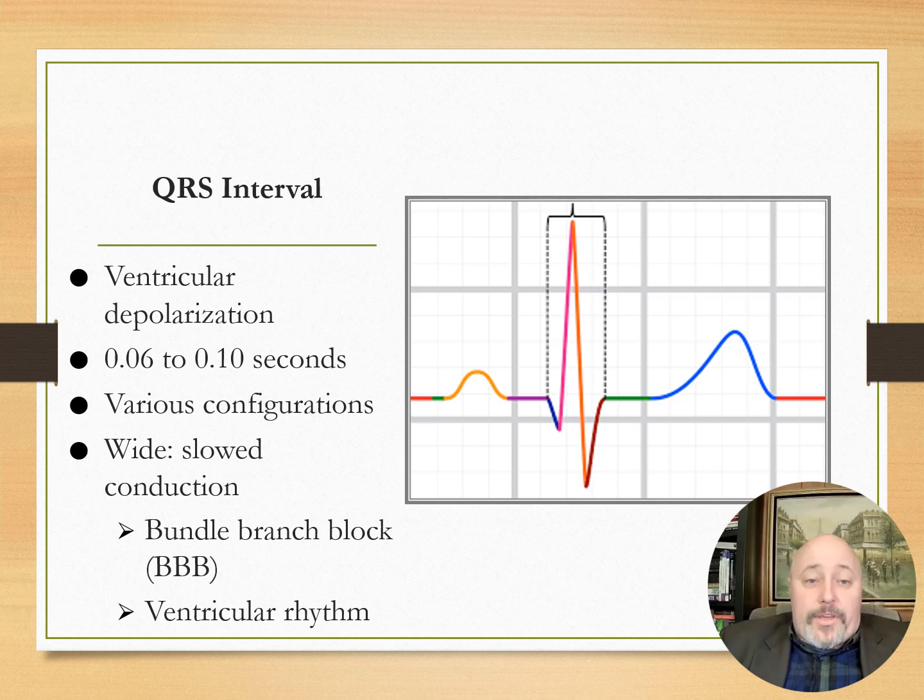On the other hand, the QRS interval is measured from where it leaves the isoelectric line of the PRI to the end of the QRS complex, and you can see we've got that mapped out here on our diagram as well. The waveform indicating the QRS complex, whether it has a Q wave or an R wave, marks the beginning of the interval. The normal width of the QRS complex is 0.06 to 0.1 seconds. This width equals 1.5 to 2.5 small boxes.